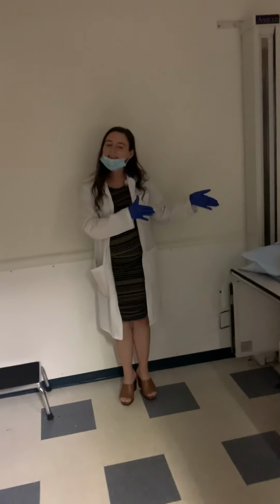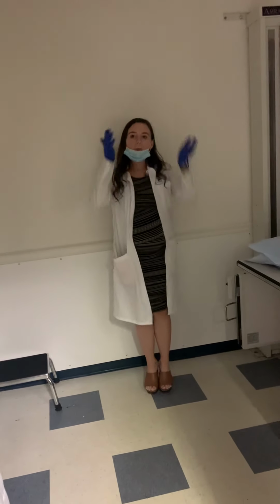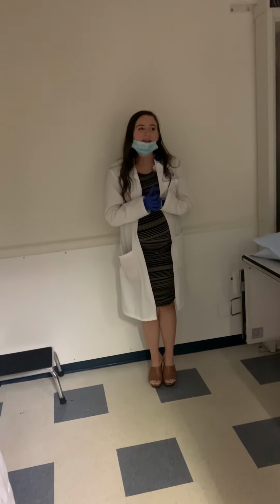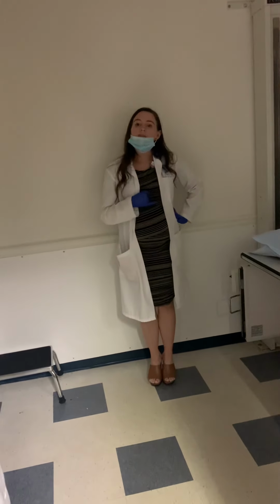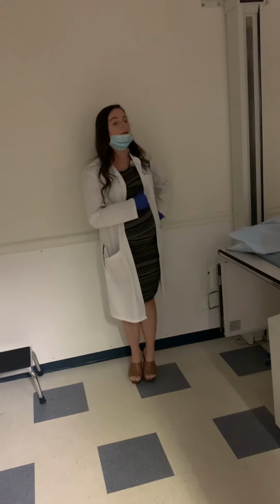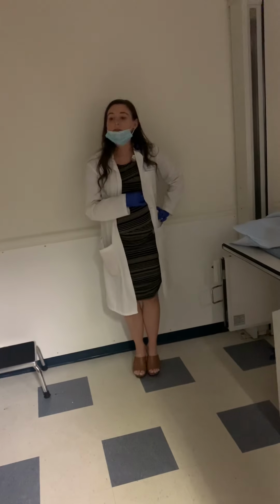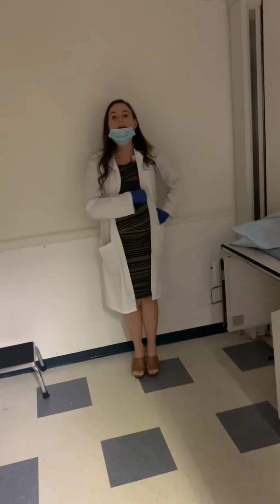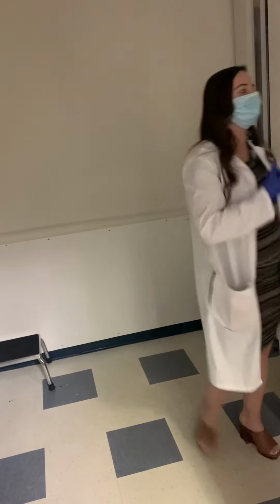Centering for this one, side to side. It's going to be noted a little different on every projection, but you always want to remember that we are imaging the stomach. So whether it says midway between the MSP and the left border of the body, that's the side of the stomach. Or it might say 1.5 inches off the spine to the side of the left lateral border. Again, still in the stomach region. Or it might say 2 inches to the left of the spine, closest to the side of the stomach. We're always concerned about this area right here. So before you walk out of the room and you expose, make sure you are on this side of the body. Most important thing. Make sure you're actually imaging the stomach.